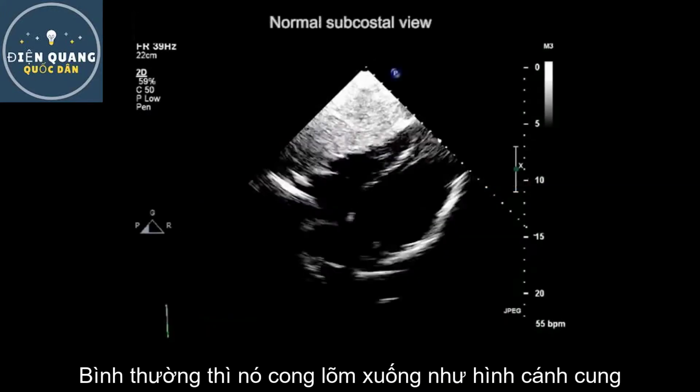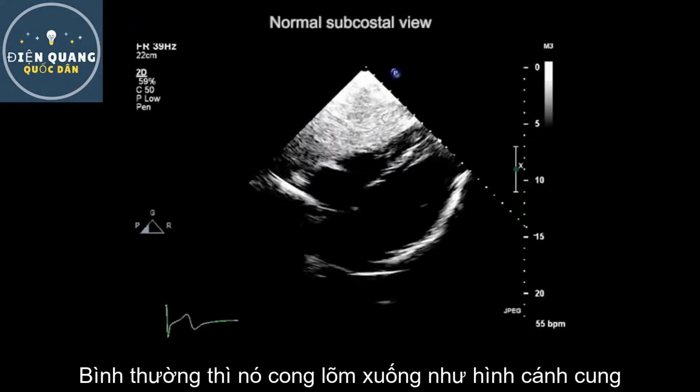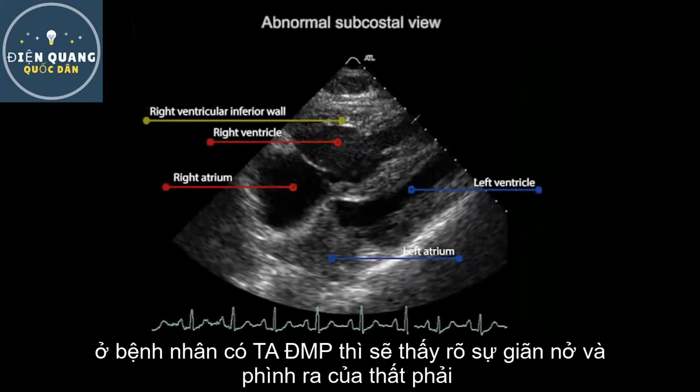In a normal individual, the right ventricle appears to be normal in dimensions and wall thickness. In a patient with pulmonary hypertension, the subcostal view clearly shows right ventricular dilatation and hypertrophy.